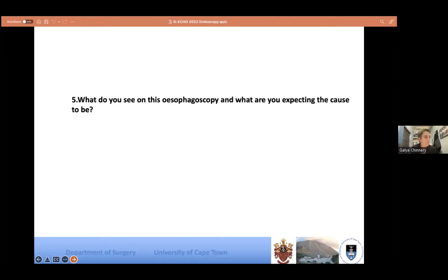To me, stenting and malignancy, tracheoesophageal malignant, let me start again. Stenting with malignant strictures for tracheoesophageal fistula always works well, in that you've already got a stricture there to keep your stent in place, and we routinely use stents in that situation, and it works jolly well. It really does. They're usually quite small, these little fistulae in a malignant setting, and are covered up quite nicely.